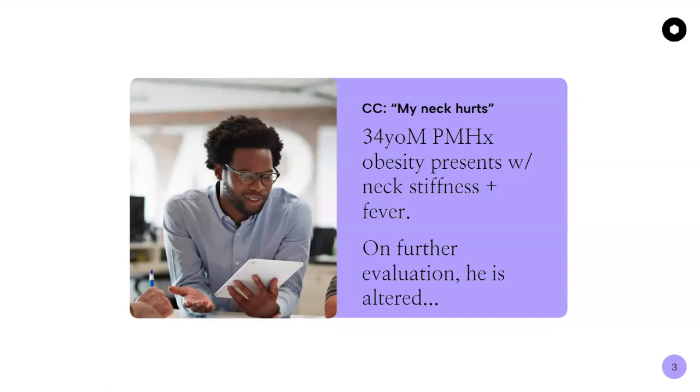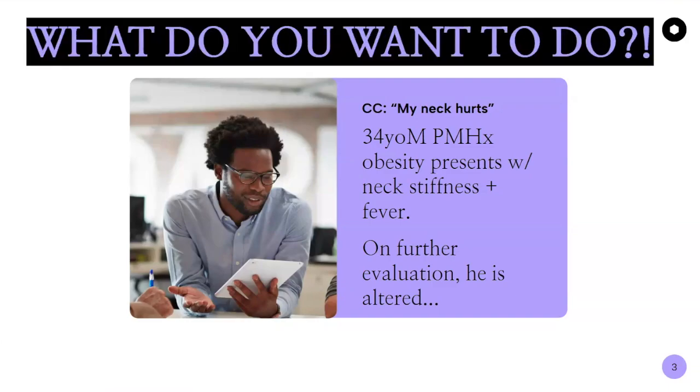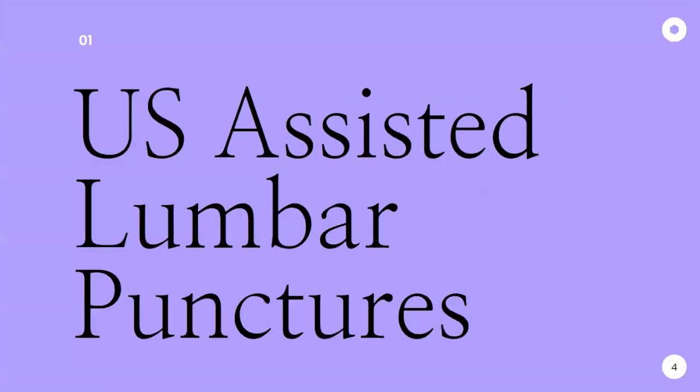So, despite your best efforts, I think no matter what road you end up going down, you are eventually going to go to a lumbar puncture, which brings me to my talk today, which is going to be on ultrasound-assisted lumbar punctures. Emphasis here on the assisted, because as we will see, we can use ultrasound to assist the procedure, but it is not a dynamic visualization of your needle going in. It's a way to enhance your technique, all right?